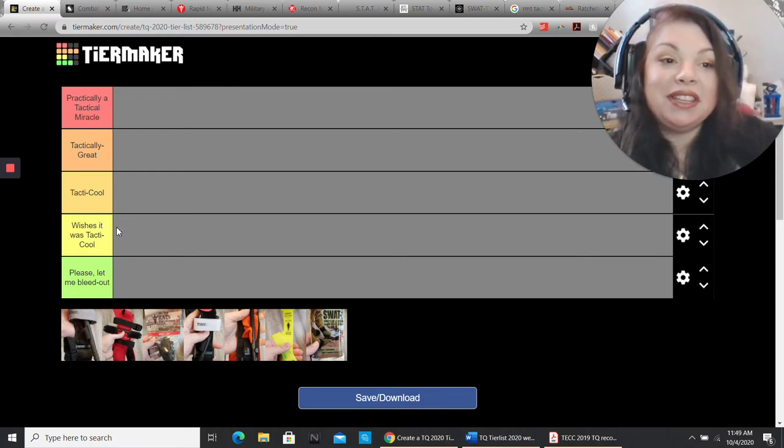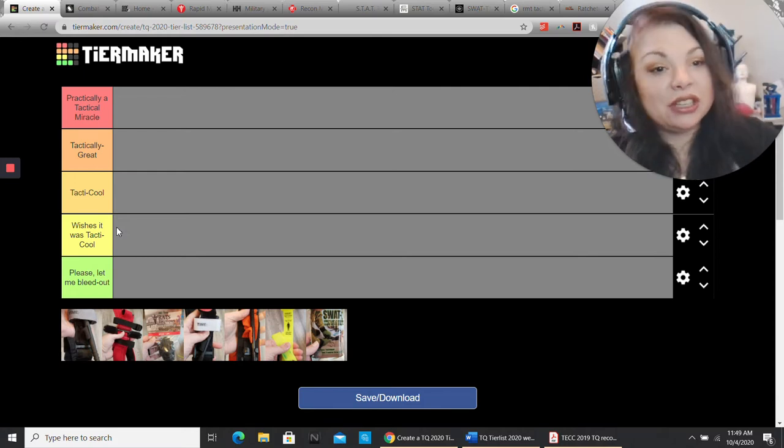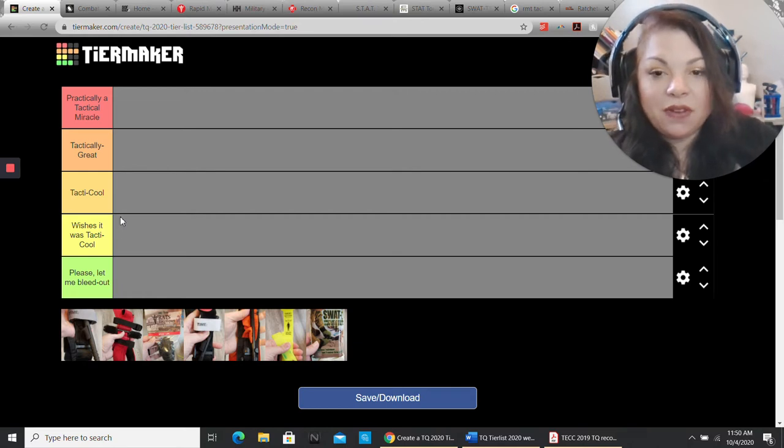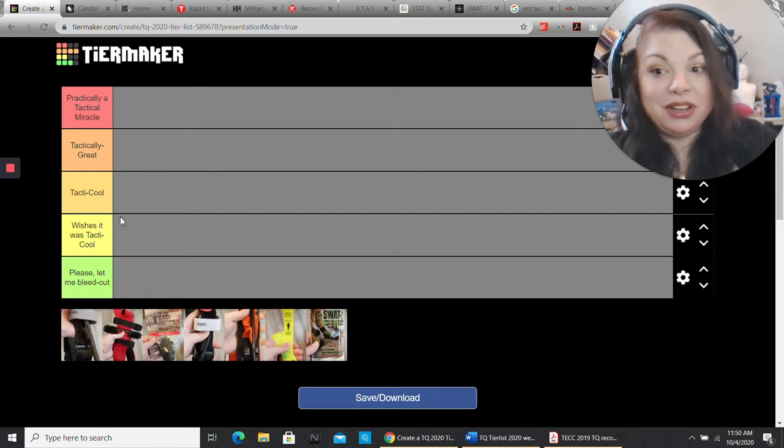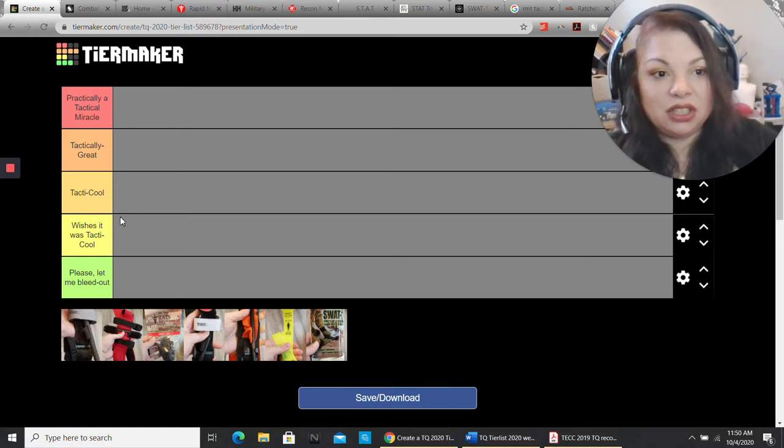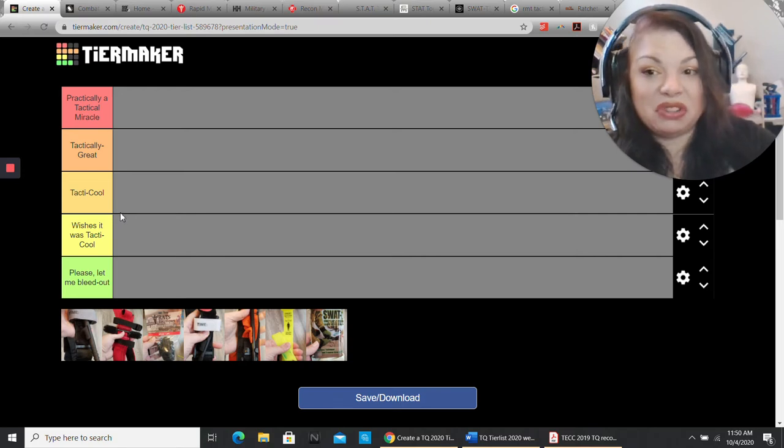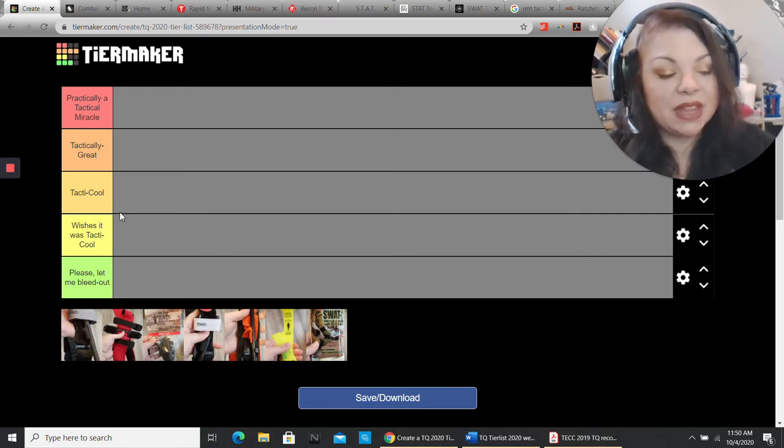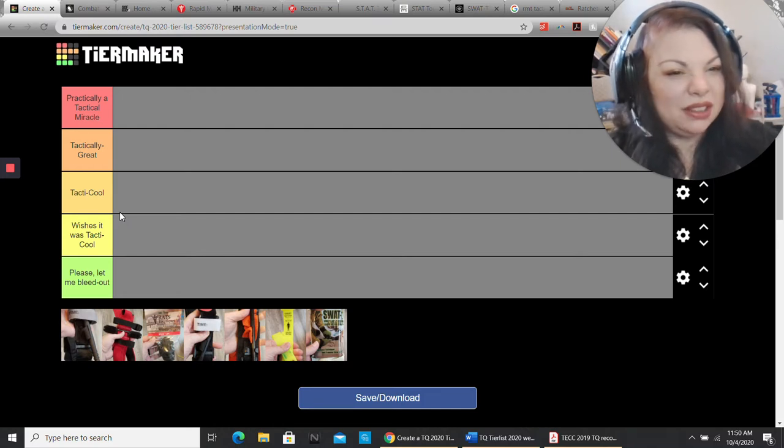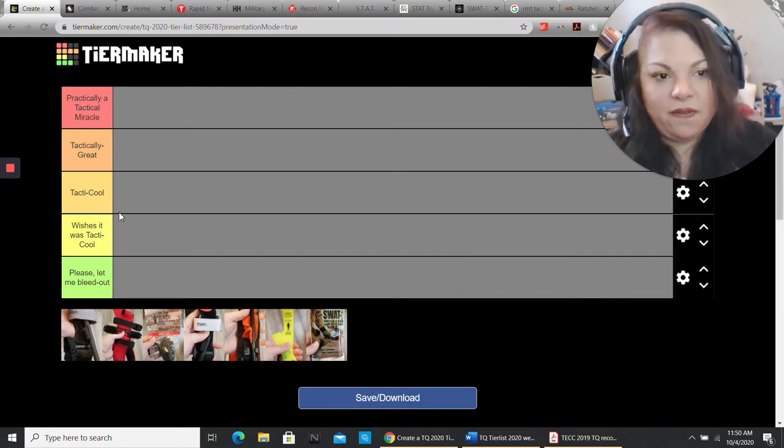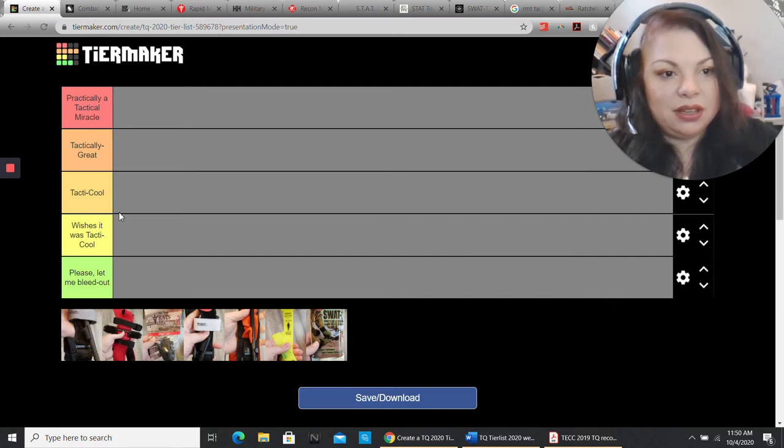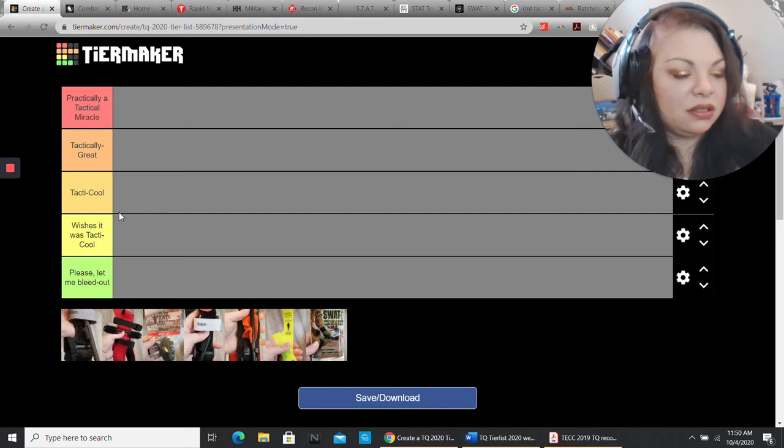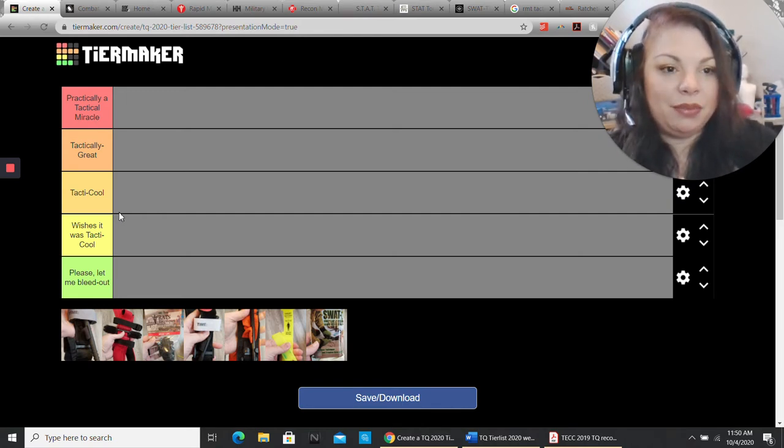Ease of use. How easy is it for someone to use? Not just when we're having a great conversation in class, but if I'm putting you through a TECC and I'm putting the pressure on you, yelling at you, are you still able to apply it? How fast can you apply it? How quickly do you get this thing out, on the limb, tightened down, secured, finished?